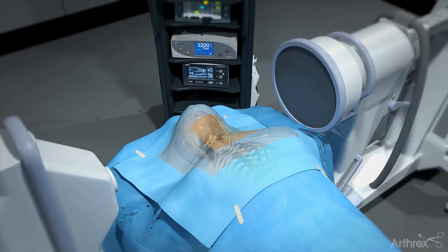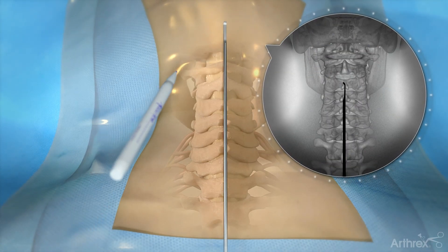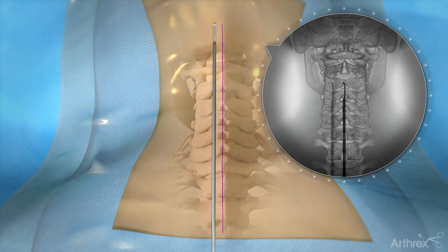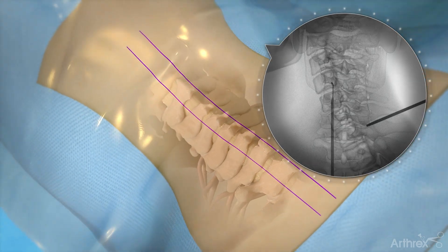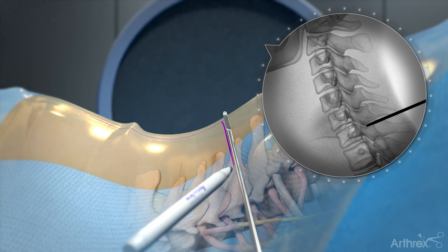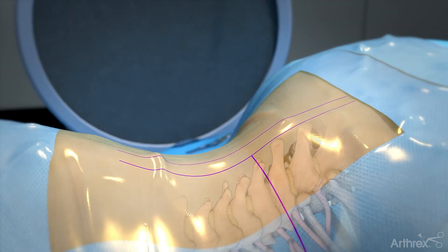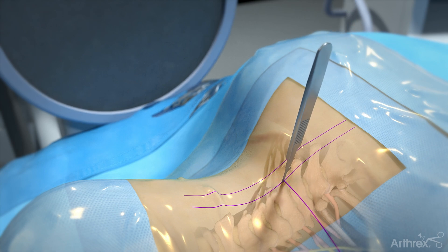The patient is placed in the prone position, using AP fluoroscopy or palpation to mark the midline. Next, mark a line over the facet joint, usually about a centimeter and a half off the midline. Lateral fluoroscopy is used to mark a line over the disc space of the level being treated based on preoperative MRI. Make a skin incision at the intersection of the lateral line and the facet joint line.